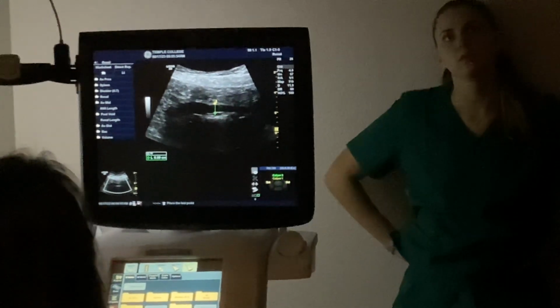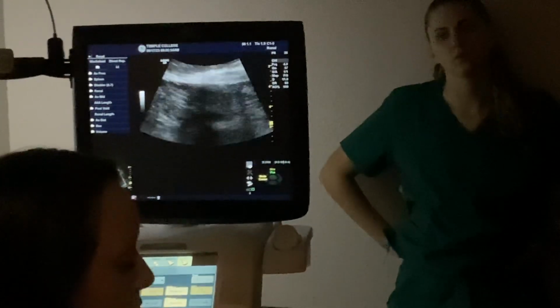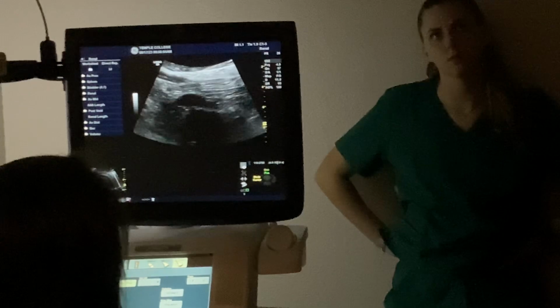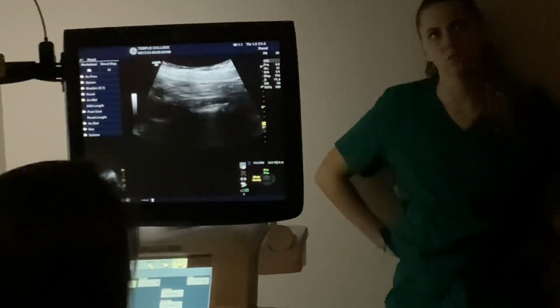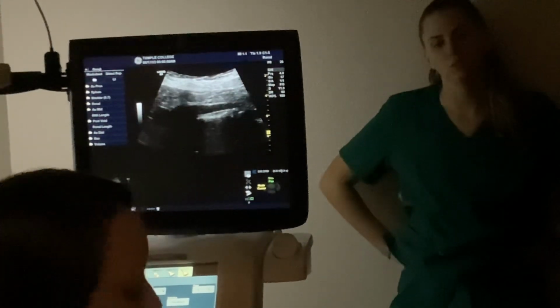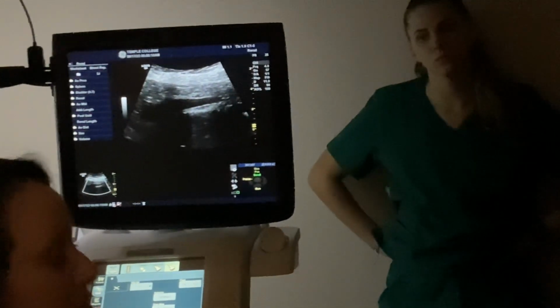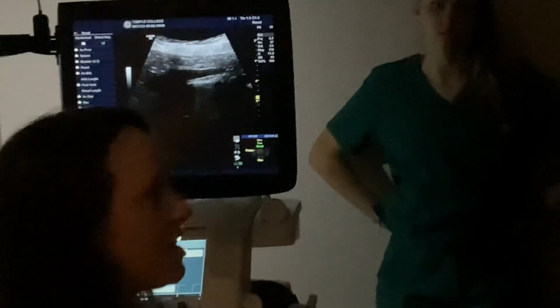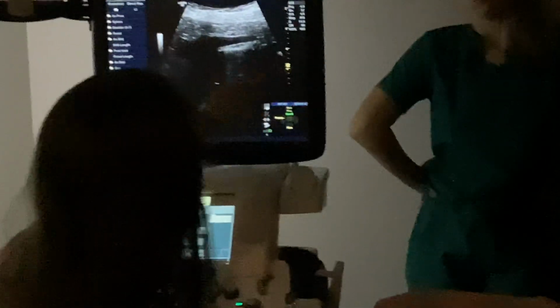And we'll show you all those motions when we do this. So you noticed me go from here, around, turn, and now I need to heel toe it. So from where I started to how I ended up taking that picture, watch here and make it happen here, but make sure we're doing it to where it looks like it's supposed to look.